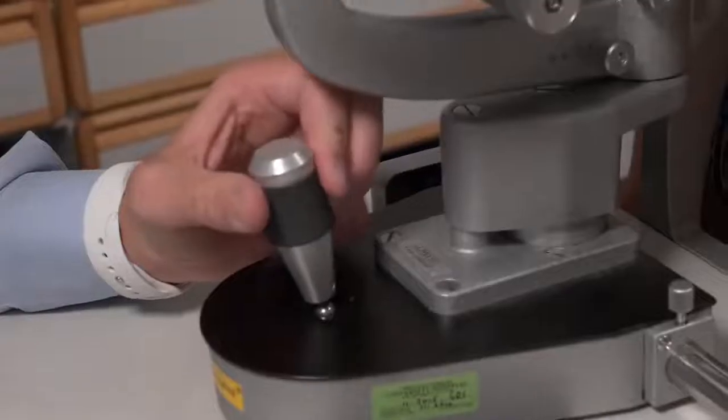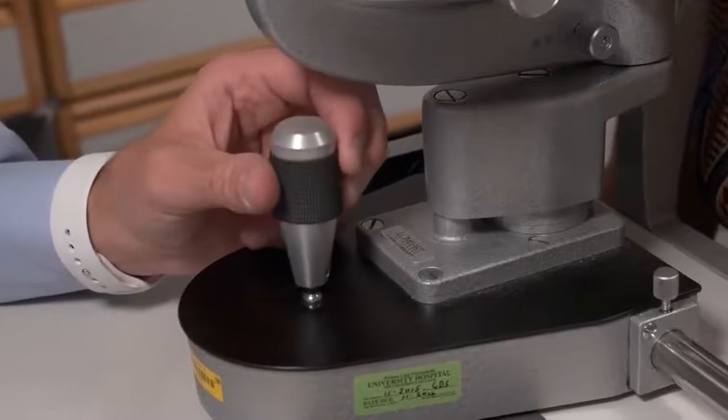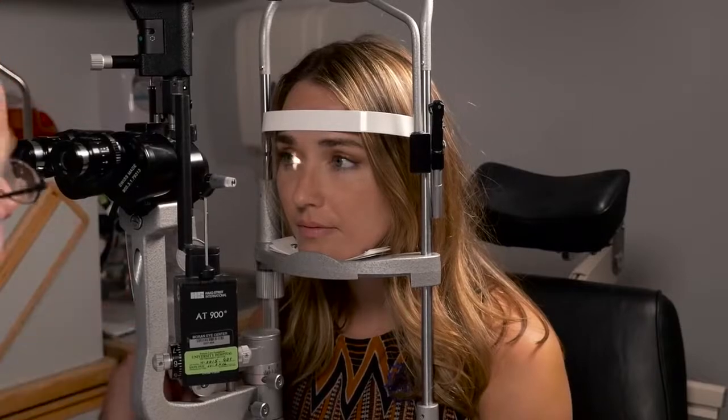All right, so first things first, you'll notice on the slit lamp, there's a joystick down below that can bring things into focus by moving it forward and back. And also you can move it left to right, and then you can spin it, and spinning it raises it up and down so you can get the eye level.